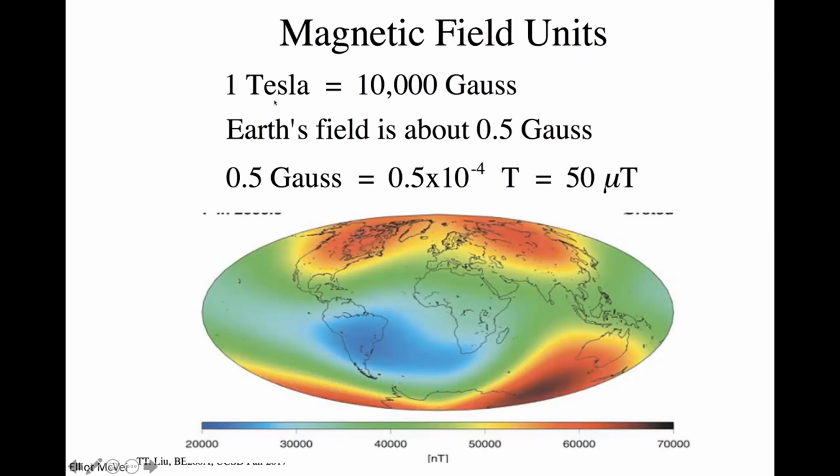So this magnetic field, a Tesla, is considerable, and probably the greatest hazard with magnetic resonance imaging is not radiation, because it's radio frequency energy. It is flying metallic objects. Because if you bring a ferromagnetic object into the room, it will get pulled into the scanner at a very high velocity.